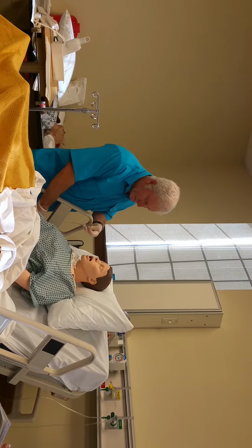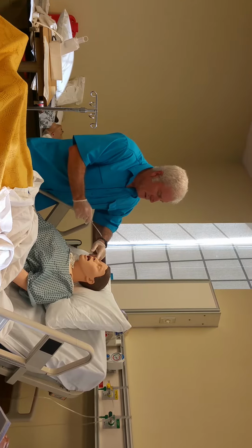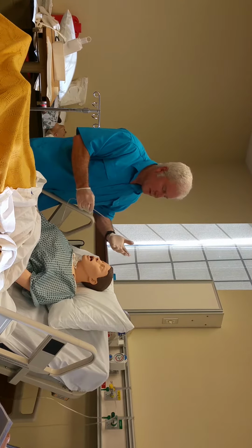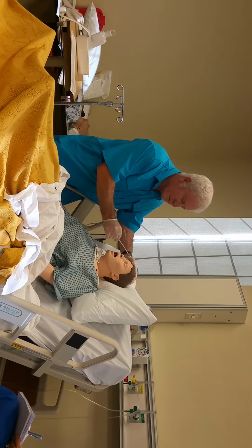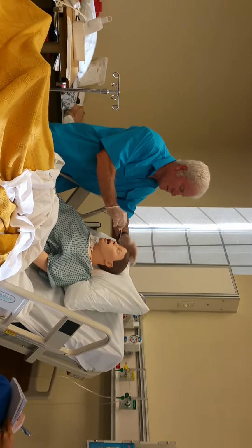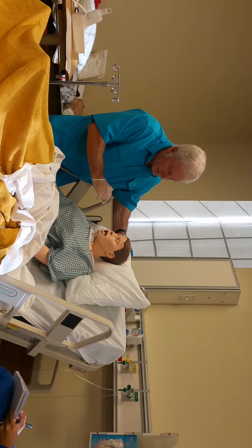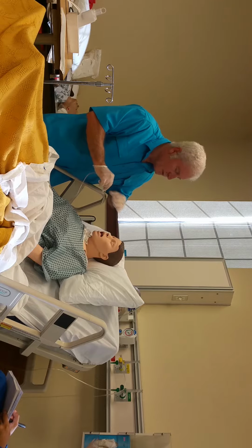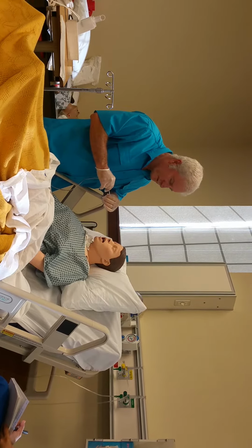Okay, so what we're gonna do is we're gonna stick this up your nose. What you're gonna feel is gonna come to a stop, and you can tell him it's his turbinates or whatever, probably not gonna make much sense. And I said, once it hits, we're gonna keep your head back, and you're gonna feel pressure, because I have to get past that, okay? And then once I get past that, I'm gonna have you lean forward and swallow for me. And when you swallow, I'm gonna advance the NG tube. So we really have to work together here.